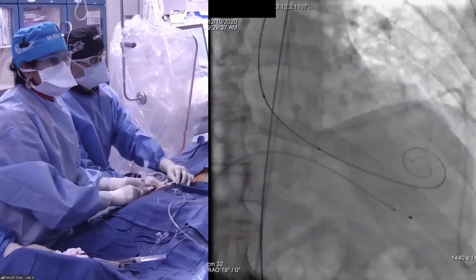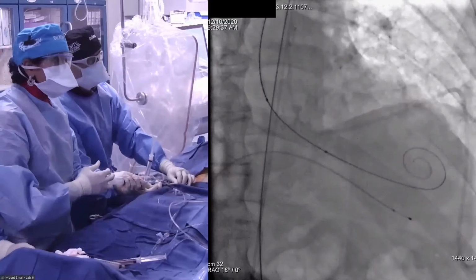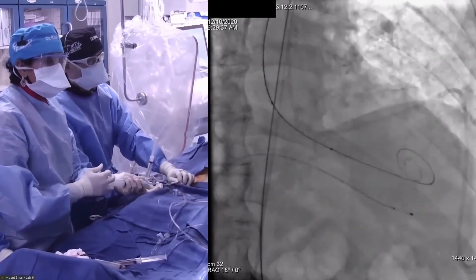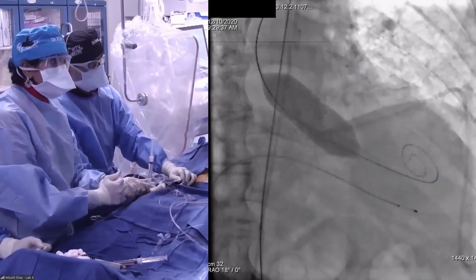I know there are a lot of concepts. Some people don't pre-dilate, some people do. And it's the Confida wire. So what's your philosophy on pre-dilation, Alex? Maybe we can hear from you, and then we'll come back to Dr. Sharma and his philosophy.